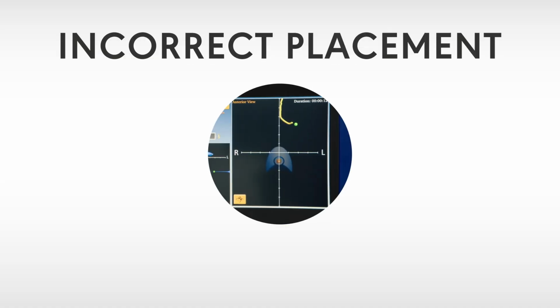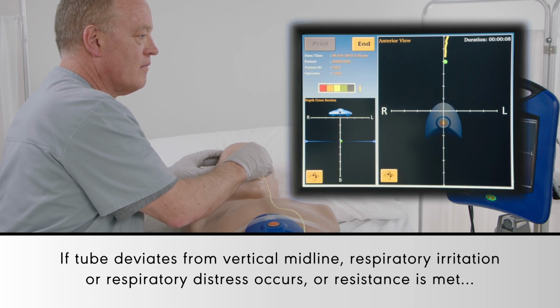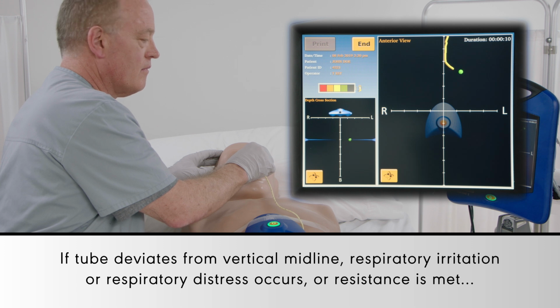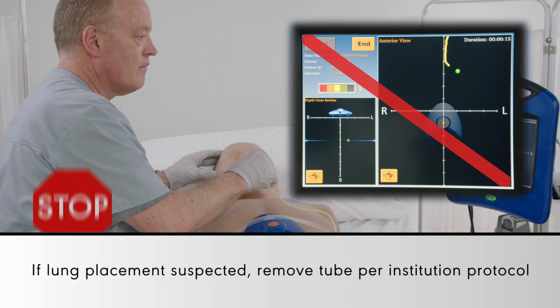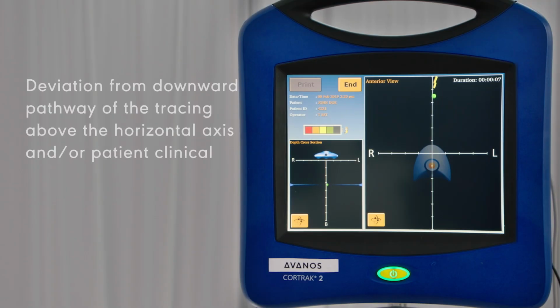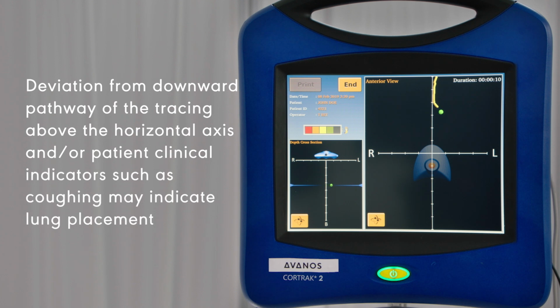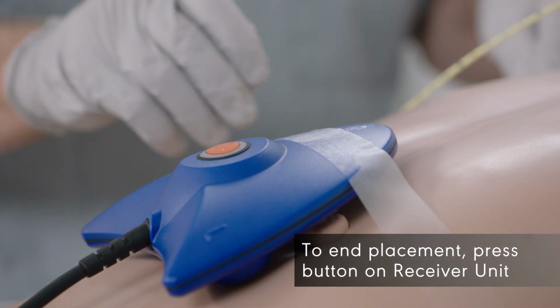Incorrect placement. If the tube deviates from the vertical midline, respiratory irritation or respiratory distress occurs, or resistance is met, stop insertion and immediately withdraw the tube. Reassess the patient and notify the physician per institution protocol. If lung placement is suspected, remove the tube per institution protocol. Deviation from downward pathway of the tracing above the horizontal axis and/or patient clinical indicators such as coughing may indicate lung placement. To end the placement, press the button on the receiver unit.